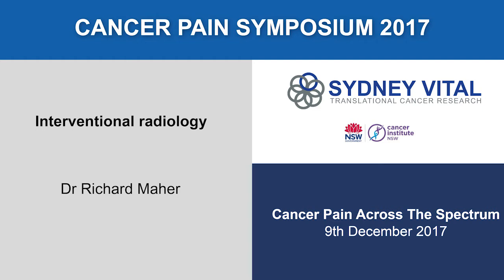So I'm just going to talk about the celiac plexus block. This used to be done a lot under fluoroscopic control, and more and more it's moving towards interventional radiologists using CT guidance. And I think it's pretty obvious why.